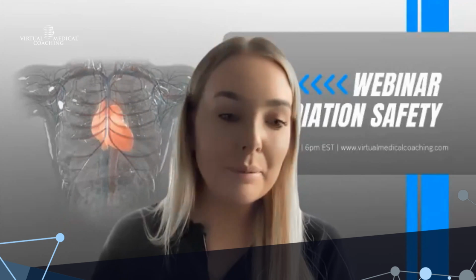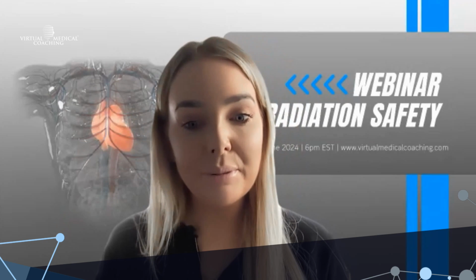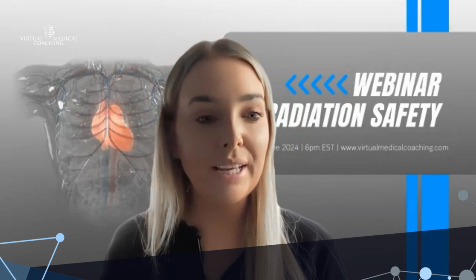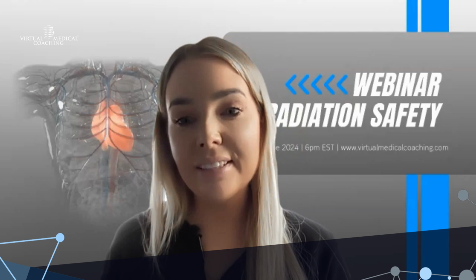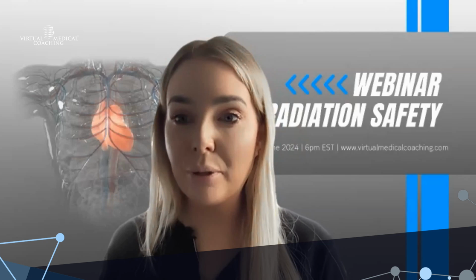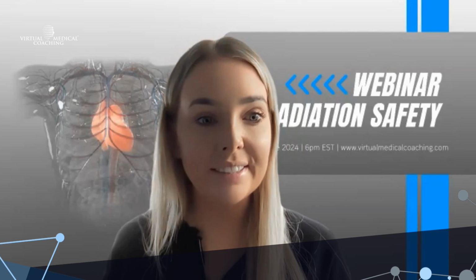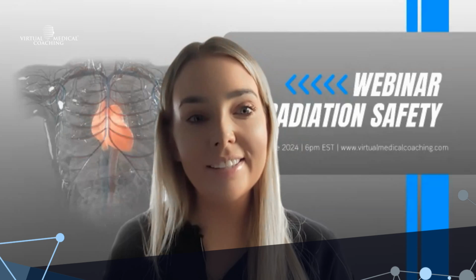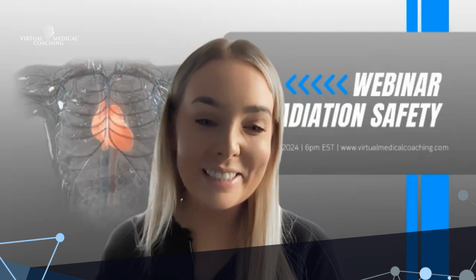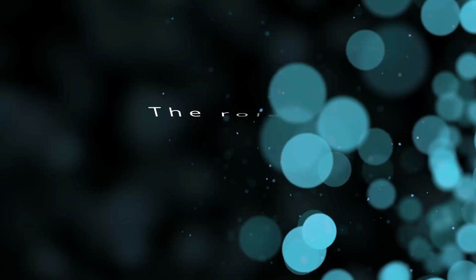Thank you. And just on that point, we do it in a very safe, controlled way. Anybody removing a lead needs live monitoring on to ensure that we have no gaps and that the system is fully optimized. There is a robust training process as well, didactic training with lots of different areas. So it is done in a very safe and controlled manner. But it's amazing to be able to give people the choice if it's something they want to do.